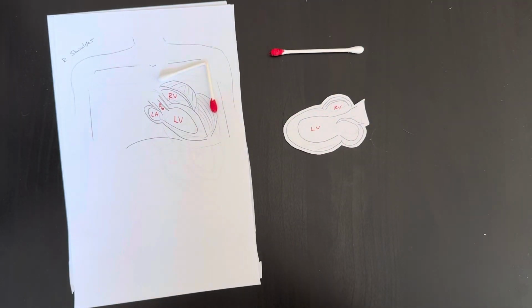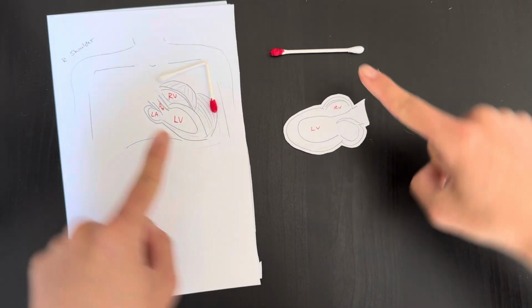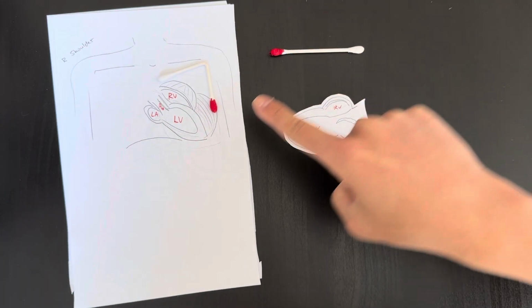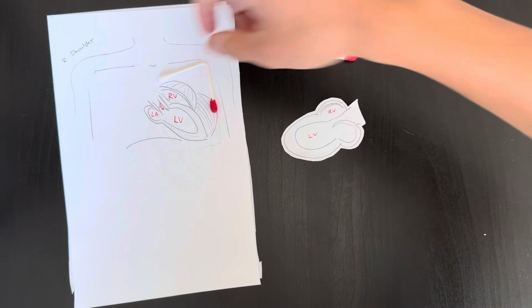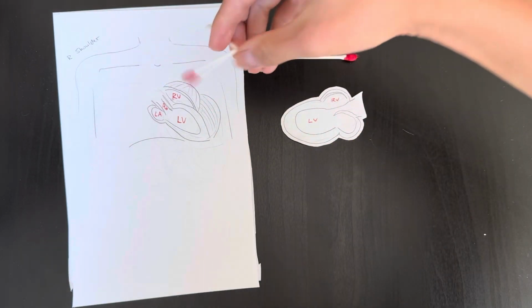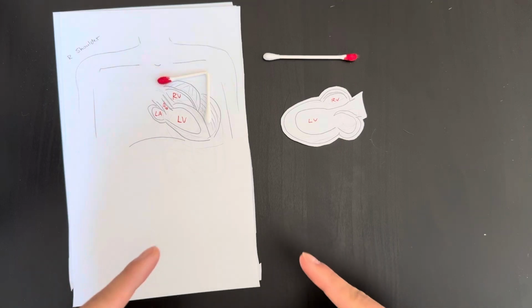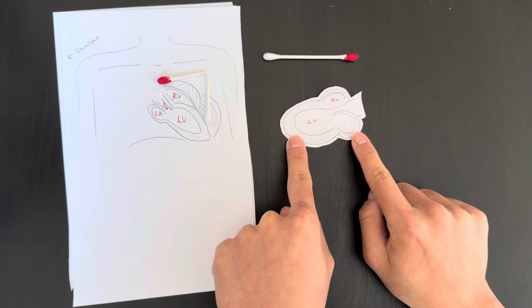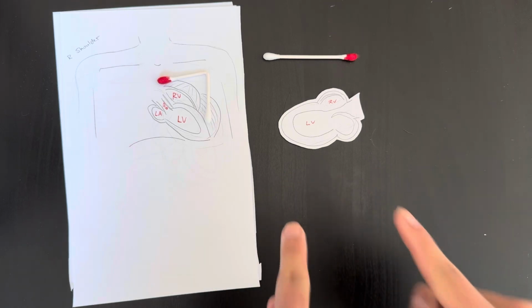And you'll notice, because the view is 180 degrees flipped from all the other views, this is a little jarring, right? Probe marker on my screen is to the left, but when I'm doing it in real life, it's pointing to my right. They're kind of conflicting. Same thing in cardiology view. If you're pointing away from the LV, you would scan away from the LV. These are on opposite sides. Because this is a backward scan, this is the orientation you do. It's weird, but the final product always comes out like this. And this is how all people like to look at a parasternal long.